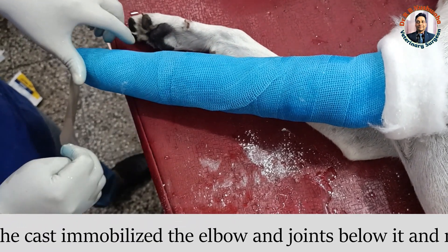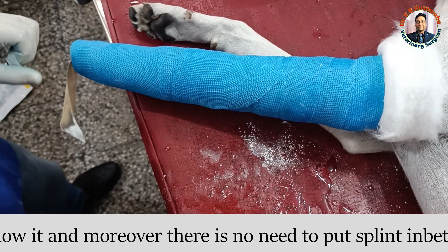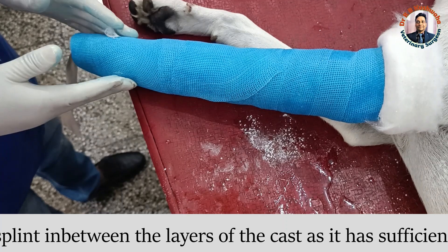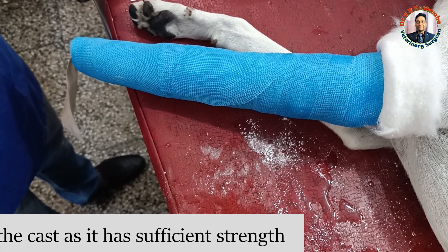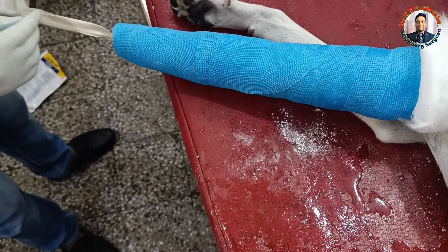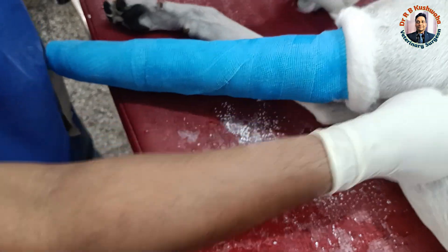Now we leave it as such for five minutes, and within five minutes it becomes very hard. This is the advantage of fiberglass — there is no need for applying a splint. Sometimes in the case of large animals, some surgeons do apply a splint because if the animal is very heavy it may be needed, but in case of a small animal there is no need. Once it's dry, we detach it from the hair, reverse it like this, and apply one zip tape. Now we can release the traction.